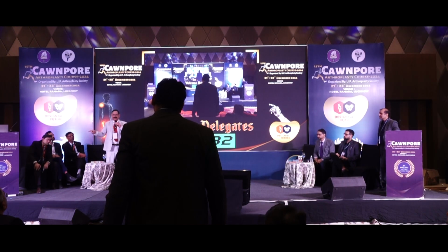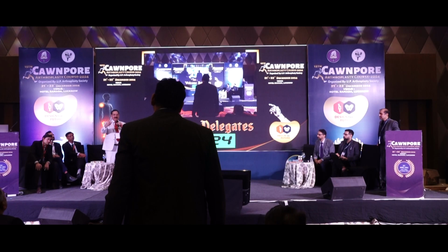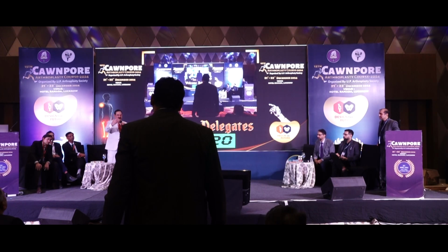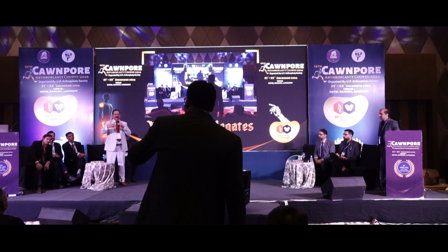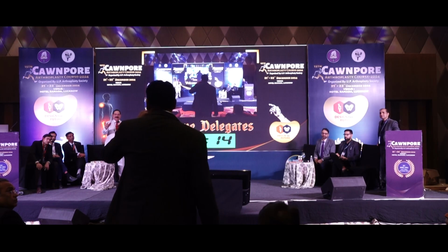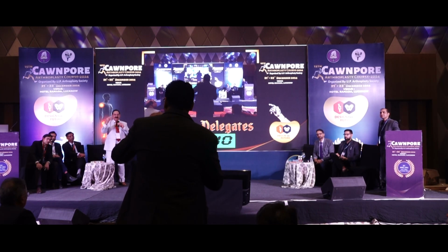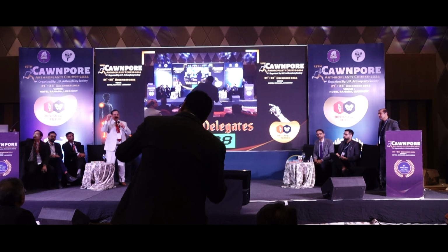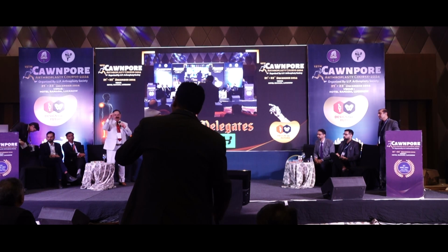So this is what discussion was going on in the previous talk. Somebody who was doing a fused hip was taking the osteophyte off at the beginning. We just said, hold on. You fit your cup and then you see. So if you are very sure this is osteophyte, you can remove it. I always remove it later on, once you put your cup, anything which is causing impingement. It is amalgamated so much that it is overhanging the cavity. So what is your take in that? Would you put your cup in even and then remove it? How do you do it?